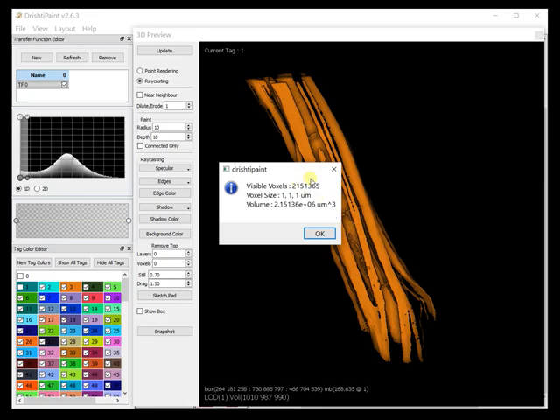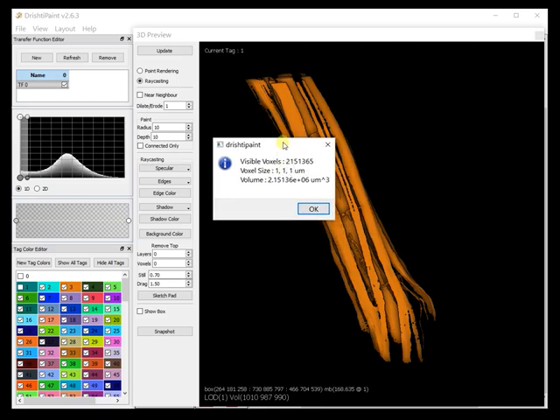That's the volume. I have not set any voxel size here so it's just counting number of visible voxels and then multiplying by the voxel size here which is one micron default. But you can set that voxel size when you are importing the data.